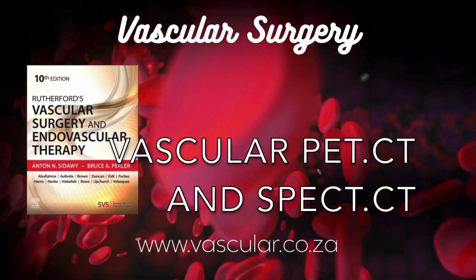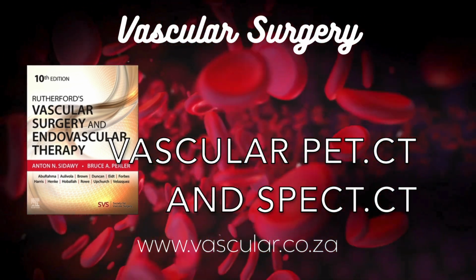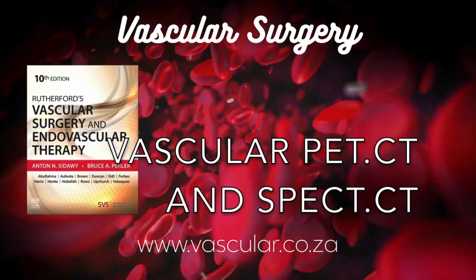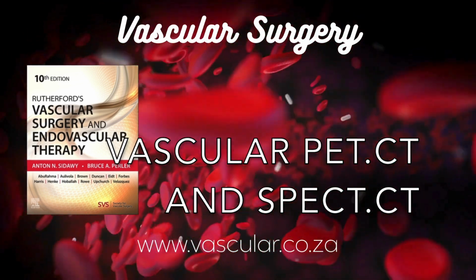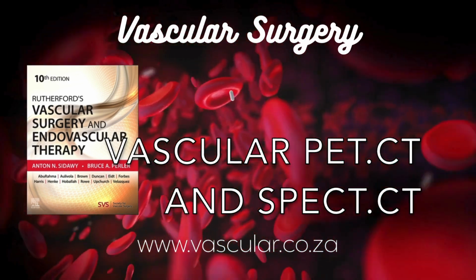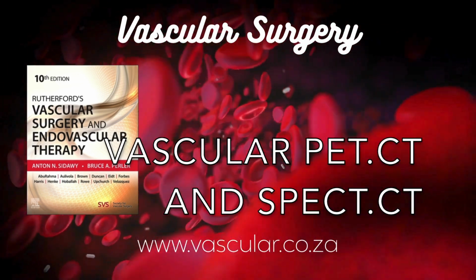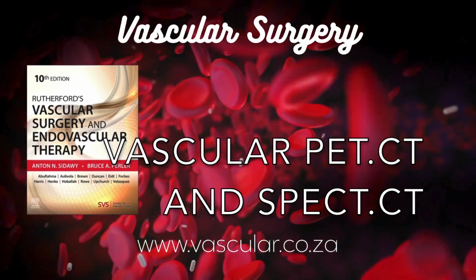What about aortic dissection? That's a tear in the aorta wall. Dissection is also known to have an inflammatory component. Studies using FDG PET-CT in acute aortic syndromes found increased FDG uptake in patients whose condition worsened. And in dissection itself? Yes, in type B dissections, those not involving the ascending aorta, higher FDG uptake near the entry tear was linked to worse outcomes, like death, rupture, or needing surgery later. So FDG might help predict prognosis.